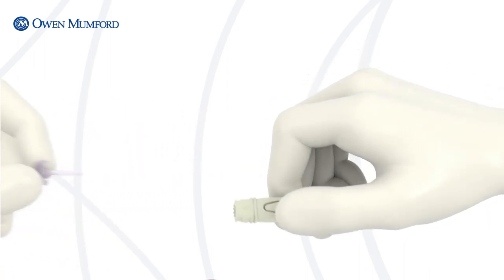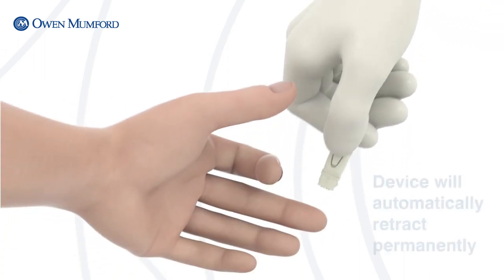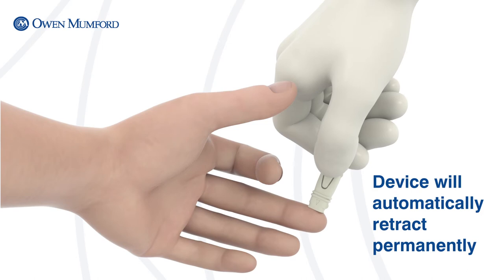Next, gently press the lancet platform against the sample site. To activate, press the side trigger button.